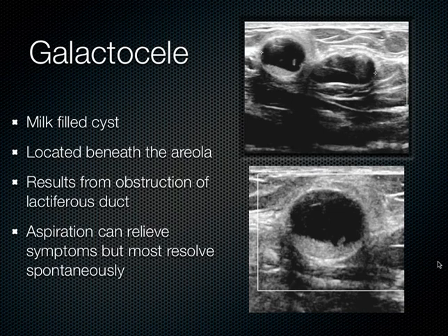Sonographically, these galactoceles can sometimes be seen as complicated cysts with some hypoechoic areas and some hyperechoic areas. Depending on the age of its contents and the amount of fat and water within, you'll see varying types of morphologies with these cysts.